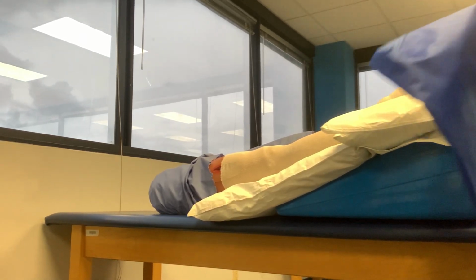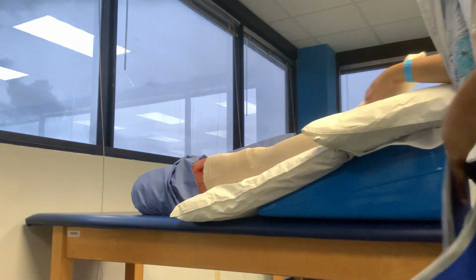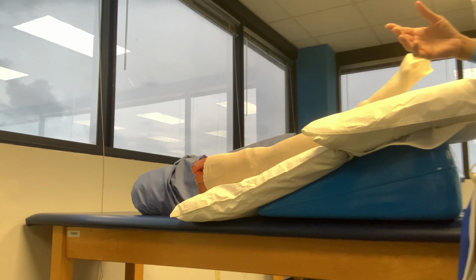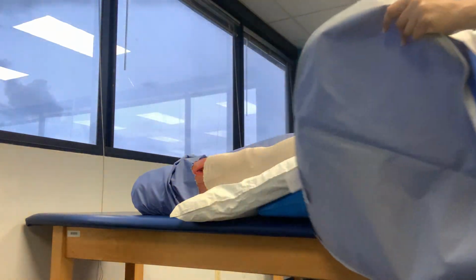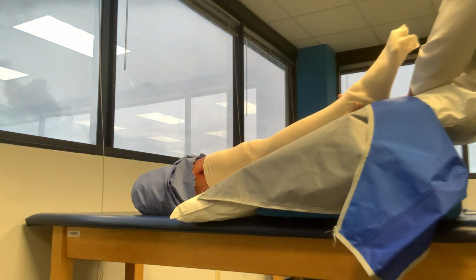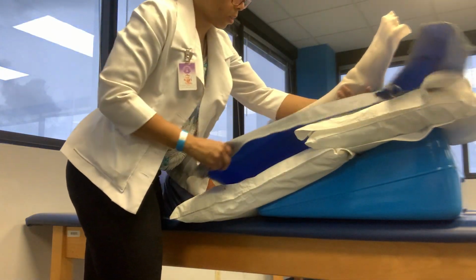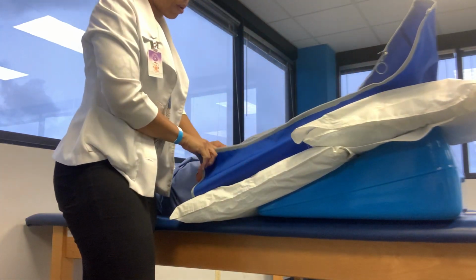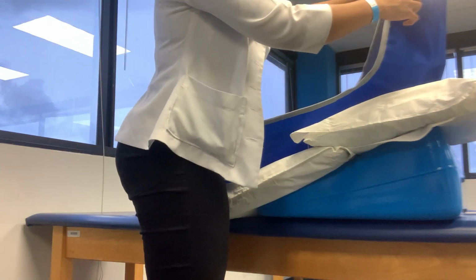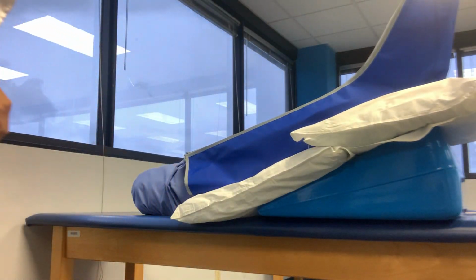So in the same way that I gently lifted the leg to put the stockinette on and also to do the assessment, it's the same way I'm going to gently lift their leg. So I'm standing this direction just so it's easier for you to see. But I'm going to lift the lid and place the sleeve underneath. So once the sleeve is placed, I'll zip the sleeve up. And then I'll attach the hose.